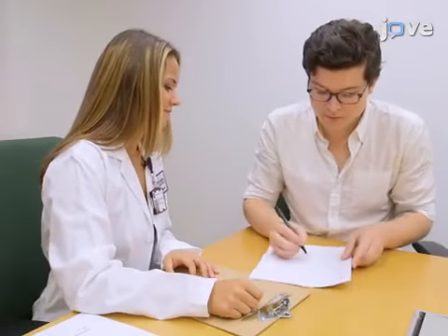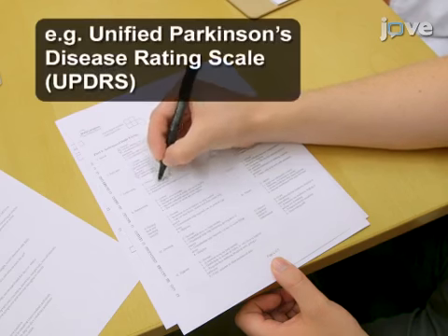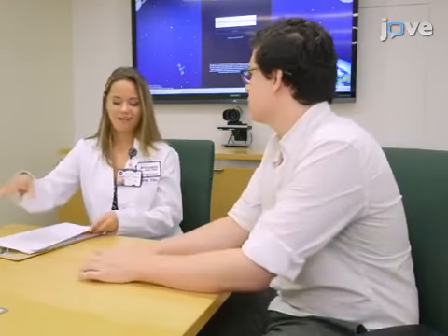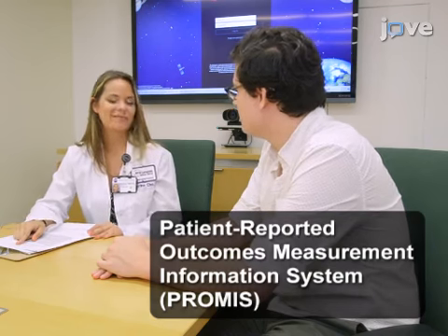Next, administer self-report questionnaires relevant to symptoms that are specific to the patient's disease. Finally, administer universal symptom rating inventories to allow for comparison of outcomes between patient populations.